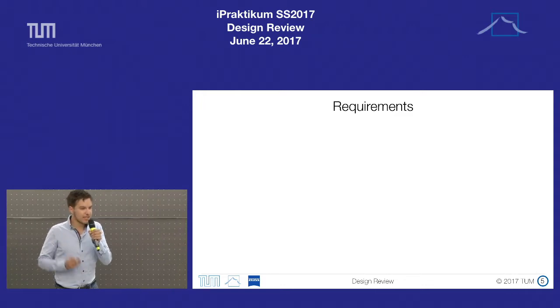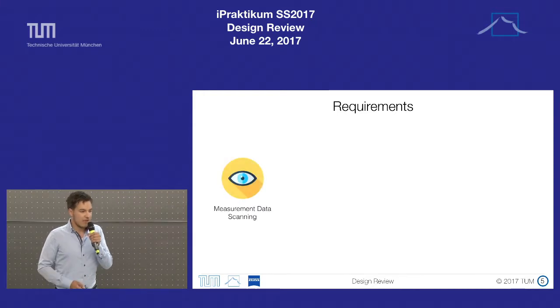We face two main challenges in our project. The first one is the automatic scanning of the measurement data. So it is required that we scan these printouts, which is basically a piece of paper, and then automatically extract the data from them. What makes it additionally difficult is that there's not only one type of printout. There are different possible layouts based on the type of measurement equipment that is being used.